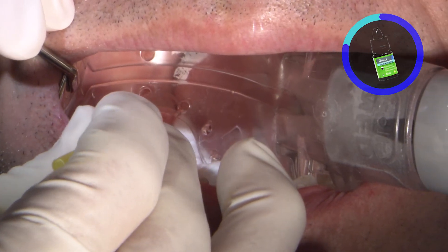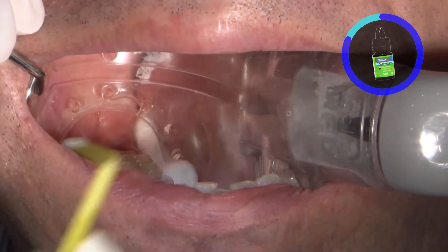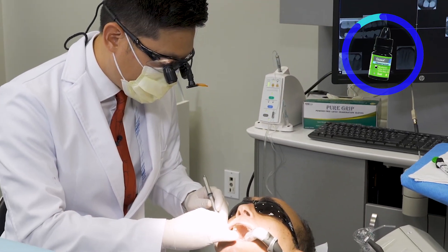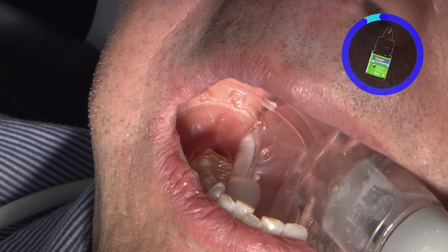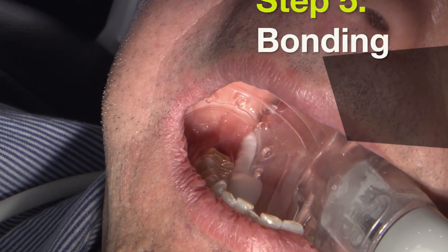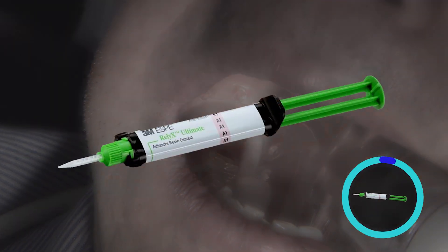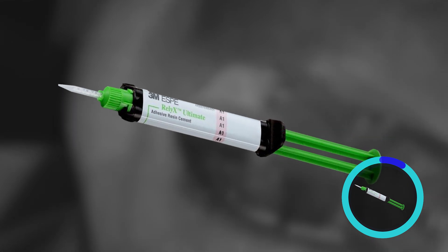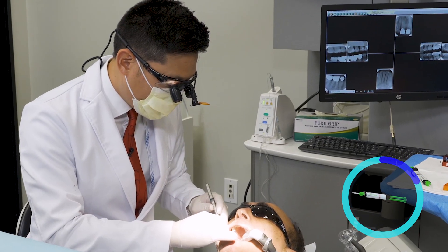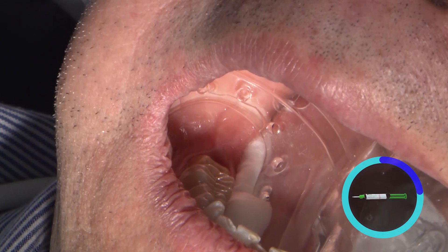After the one to two minutes have elapsed, we actually don't want to rinse it off. If I see a lot of excess desensitizing agent, we'll blot dry it with a cotton pellet or aspirate the excess with suction. To bond this restoration in, we're going to use 3M's Reliax Ultimate, which is their adhesive resin cement. The adhesive resin cement does require an additional application of a bonding agent onto the preparation.